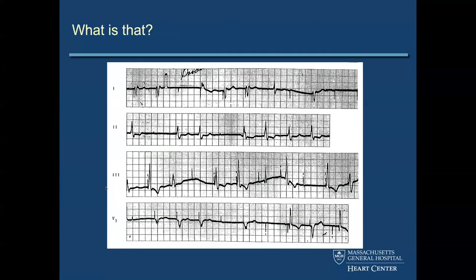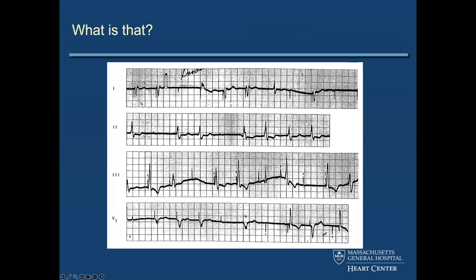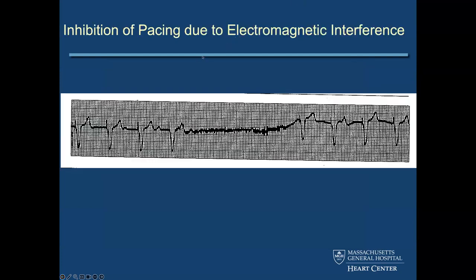One thing, so in the chat, someone had pointed out magnet or MRI. So I think MRI could make some sort of noise inhibition, but a magnet itself on a pacemaker would actually cause it to pace in magnet mode, just for clarification. So a normal magnet response of a pacemaker is to pace asynchronously at a rate indicating the battery status, which is actually a way that you can ensure a patient gets support while you're doing surgery if you're using any kind of electrocautery. But an MRI machine itself, Dr. Ptaszek, I'm sure you can probably expand on this, can cause inhibition.